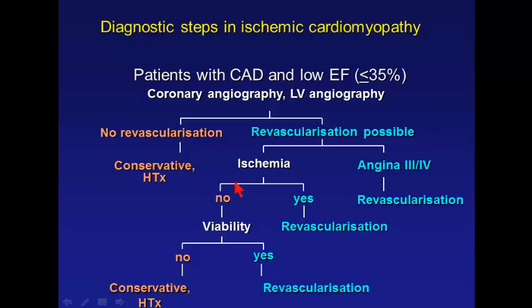It doesn't mean, however, and that's a misunderstanding of that concept, that patients where we look for viability have no ischemia. Having hibernating myocardium means there is constant ischemia. There is all the time, whenever oxygen consumption should increase, ischemia. And that's why they have repetitive stunning, and that's why they have hibernation. So they do have ischemia, but the flow is so low that, for example, with SPECT, we cannot see that when we stress the patient, there is even more perfusion abnormality, because it's just so abnormal that we cannot induce further abnormality.